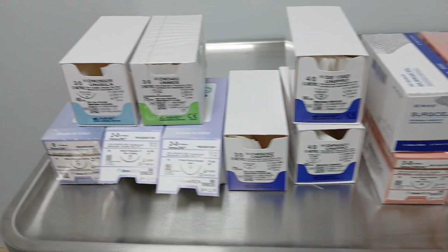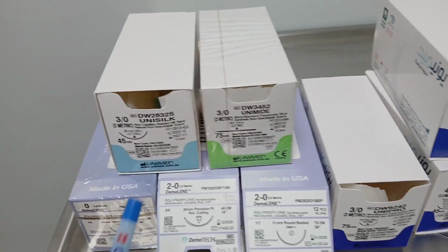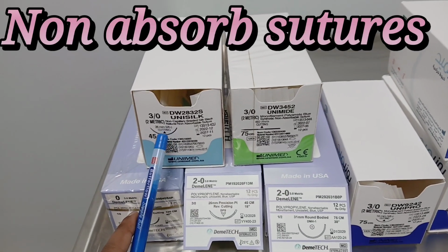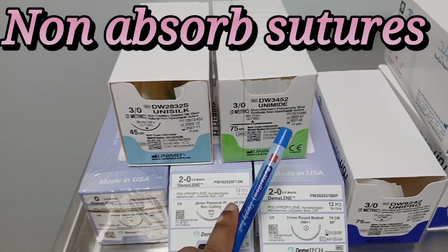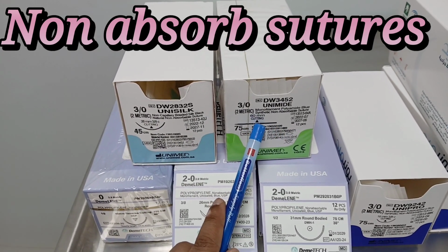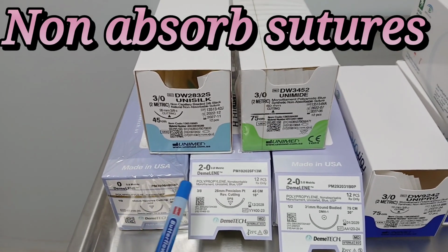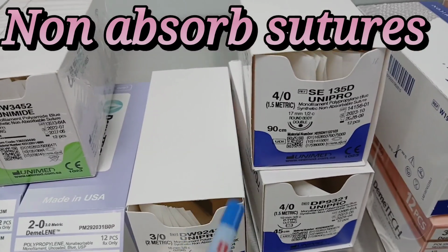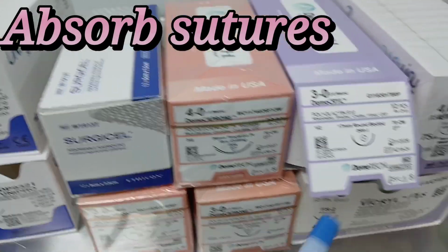Now here I will tell which suture materials are absorbed and non-absorbed. Silk, we can say unisilk or mersilk. This one is non-absorbed suture. Ethilon, this is also non-absorbed suture. Prolene, non-absorbed suture. These are all prolenes. Then monocryl, absorbed suture.